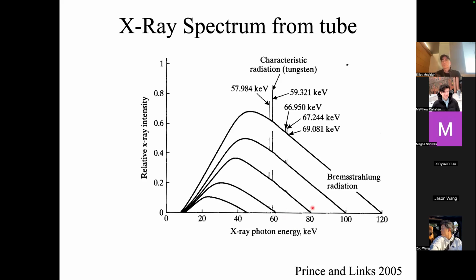So this is what the Bremsstrahlung radiation looks like when you graph how much you get at each energy. This is X-ray photon energy across this axis, going to higher and higher energies. And this is the relative number of X-rays emitted from our target. And it's just normalized. You could say we'll normalize it so the integral under one of these curves is 1.